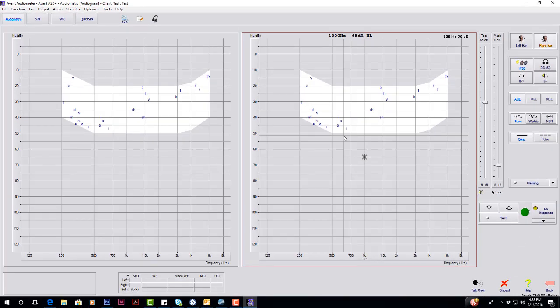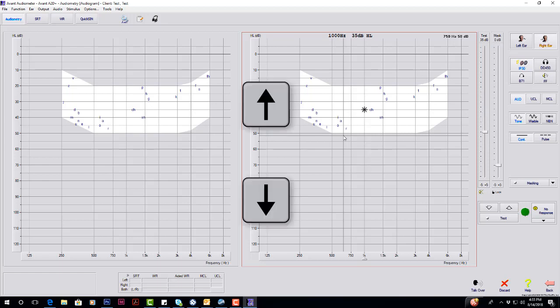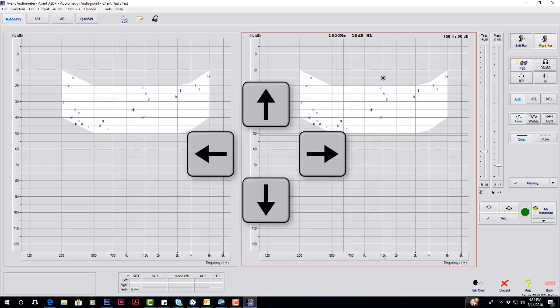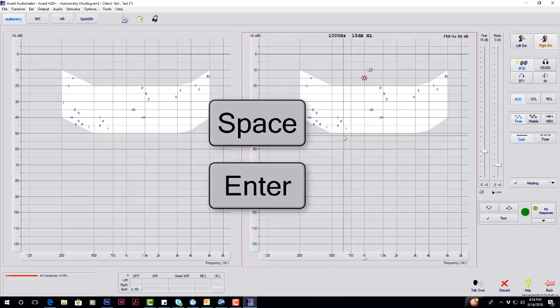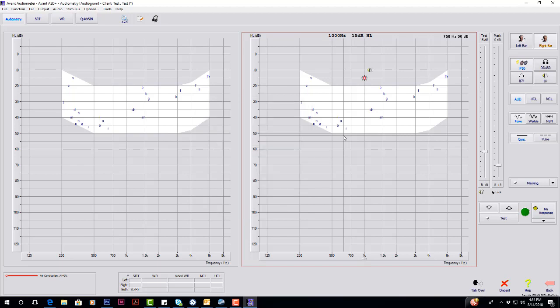We are replacing the knobs and buttons with your up and down, left and right arrow keys. You're going to use spacebar or enter to present. Holding down the spacebar presents the signal; when you let go, the signal is not being played.